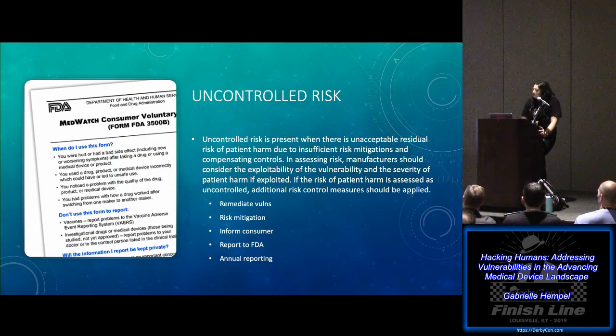An example of uncontrolled risk could be as follows. A hospital submits a report that a patient was harmed after a medical device failed to perform as intended. Upon investigation, it was determined that the medical device malfunctioned as a result of exploitation of a previously unknown vulnerability in the software. The outcome of the investigation and impact assessment determines that the exploit impacts the device's safety and essential performance and could have contributed to the patient's death. A report is filed in accordance with the reporting requirements, and the manufacturer notified its customers and develops a validated emergency patch to remediate the issue.